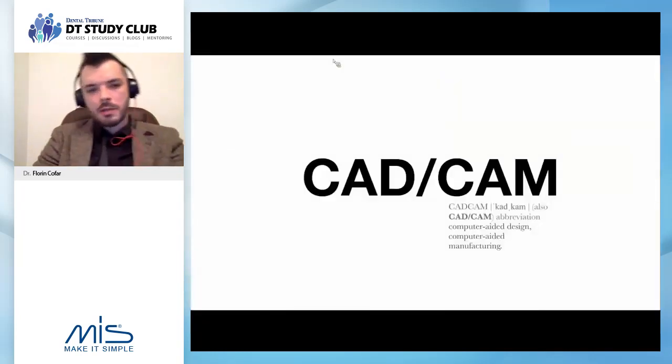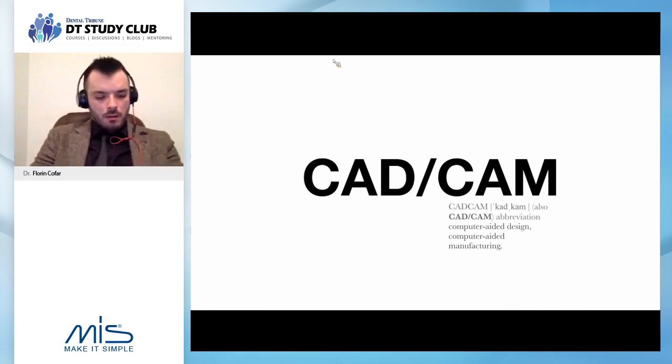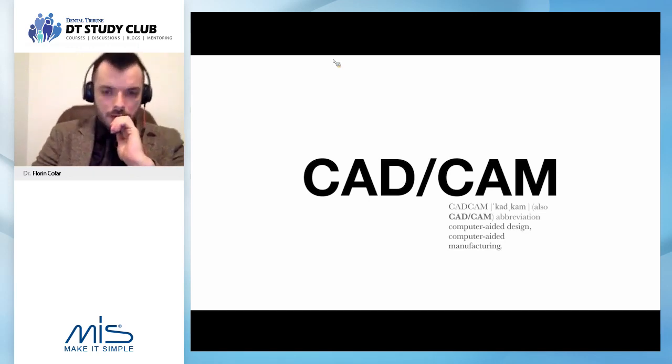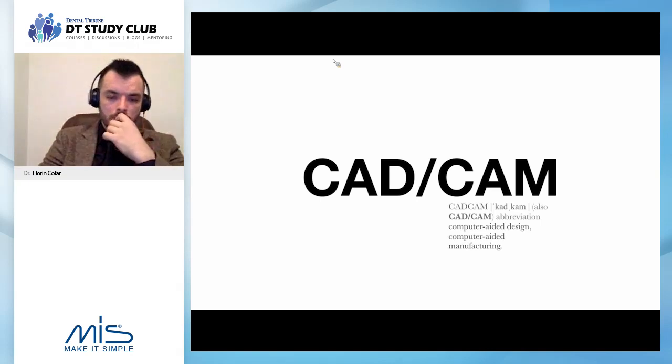Now let's talk a little bit about CAD/CAM. CAD/CAM has been around for how long? I think 30 years. I think one year ago, Sirona, which was the first company, celebrated like three decades. And when we're talking about anterior aesthetics, more or less we can say, as a majority of opinion around the world, CAD/CAM has failed when it comes to matching the, let's say, the artist, the handmade. People usually will tend to use CAD/CAM for anything other than anterior restorations.